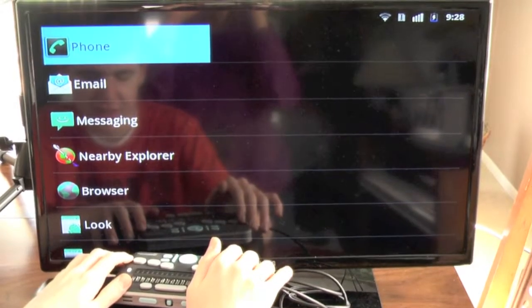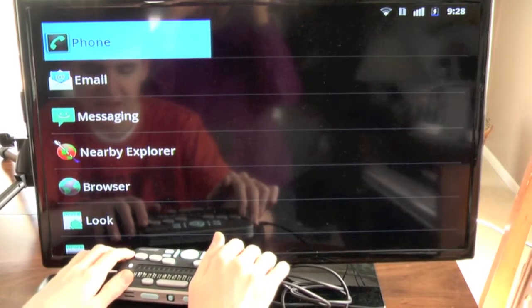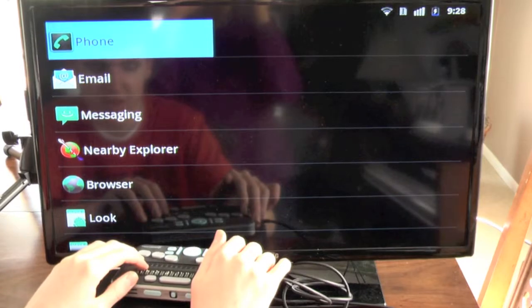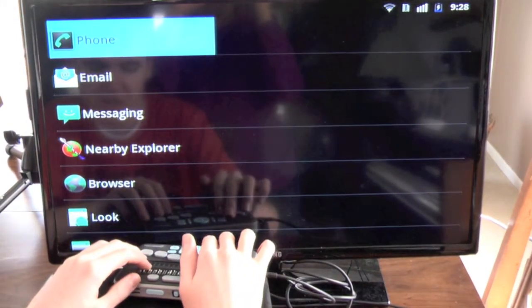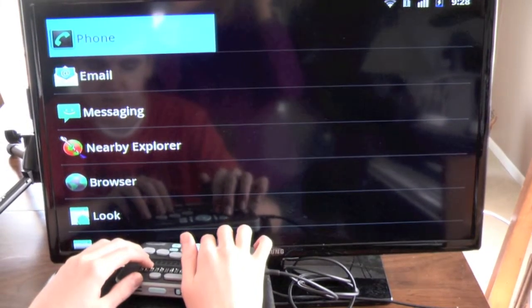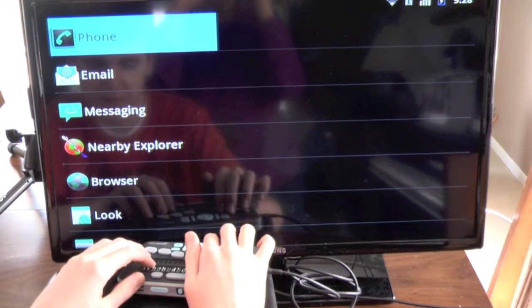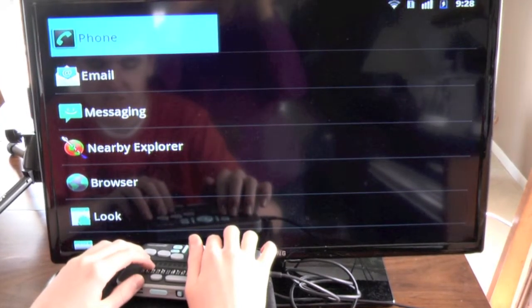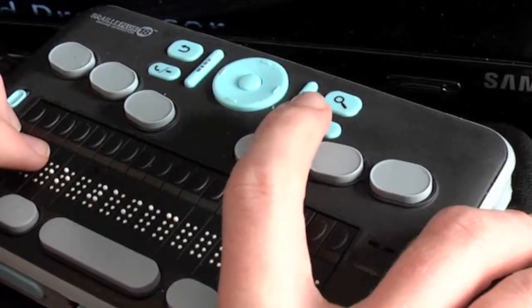To set the date and time on the Braille Plus 18, we need to enter the Speech and Braille Preferences dialog. We can enter this dialog by holding down the S2 key. This is the oval-shaped key located below the search key on the top right of the face of Braille Plus 18. It's located right about above dot 5, and it's an oval-shaped button if you want to find it that way as well. So let's hold down this button, which is again called S2, for about a couple of seconds, and we will enter the Speech and Braille Preferences dialog.